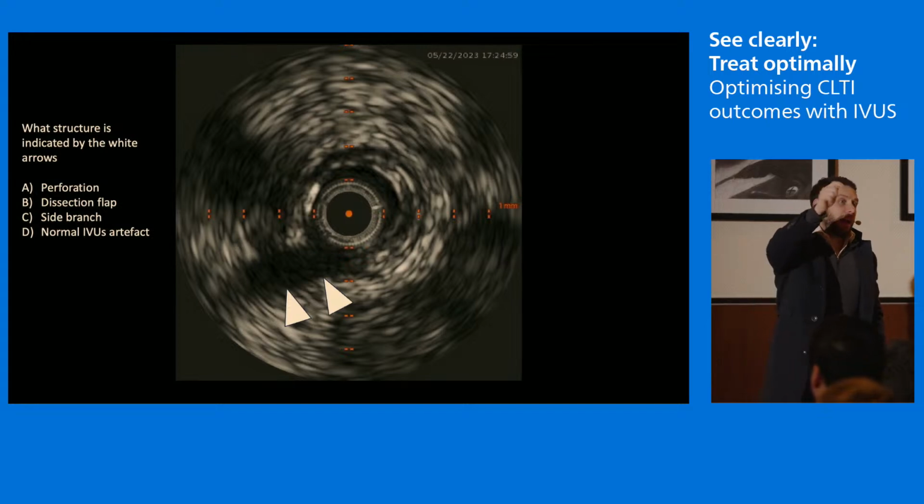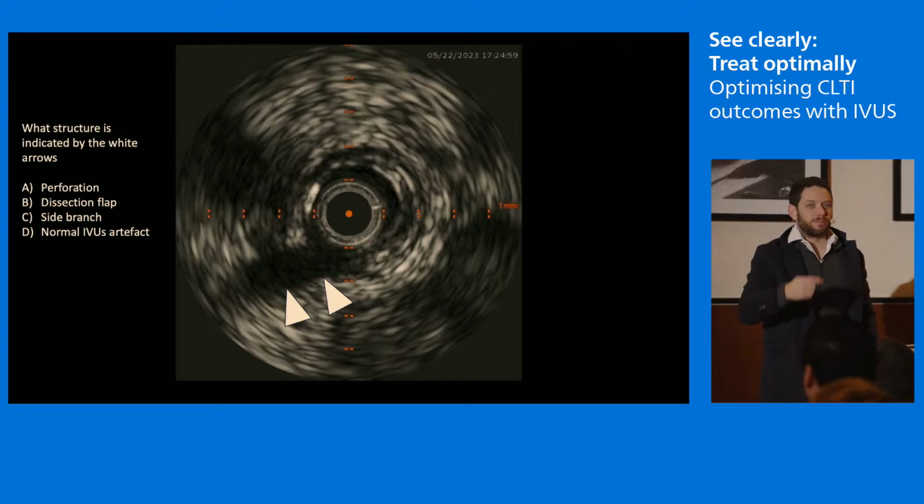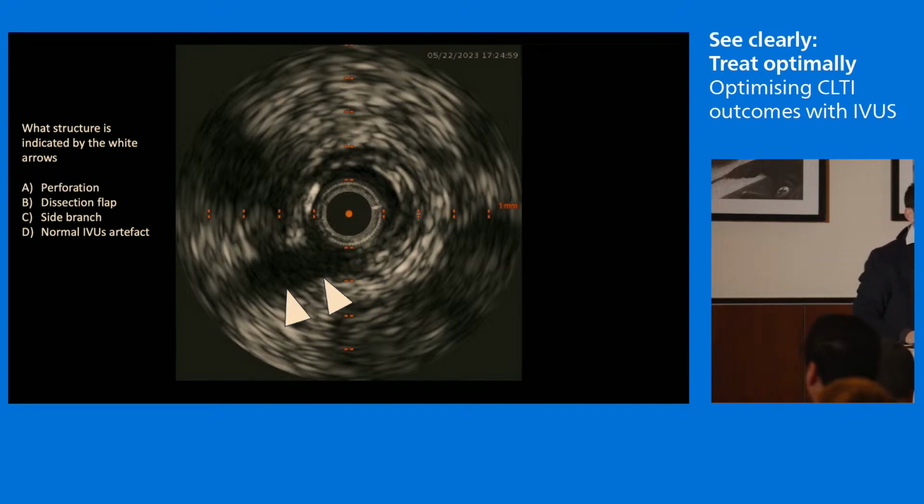And then you can take an angled catheter and plug in exactly there, as opposed to basically looking in the dark. Because a lot of these patients have distorted anatomy, or big collaterals that might look like a PT, and you start digging down something which never goes to anything. Finding the hidden peroneal origin is a good example of that. And finding an aberrant origin of an AT is another good example, where you never had a hope in hell if it comes off high takeoff in the middle of the popliteal.